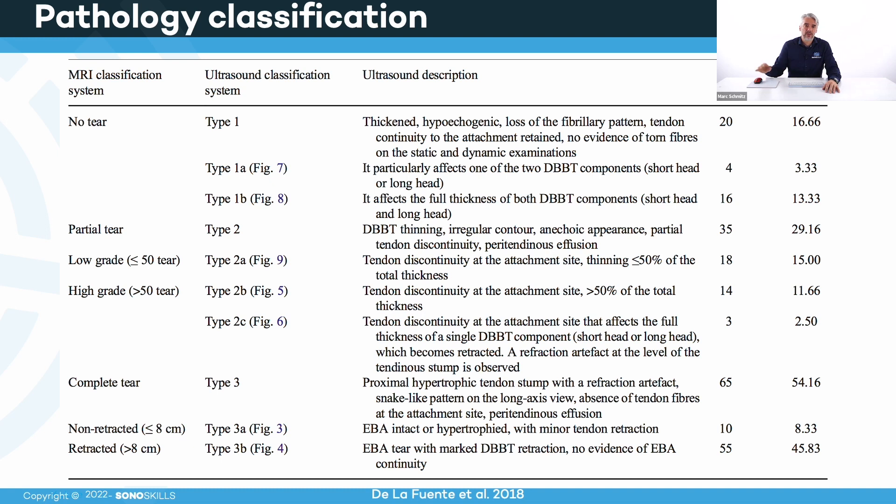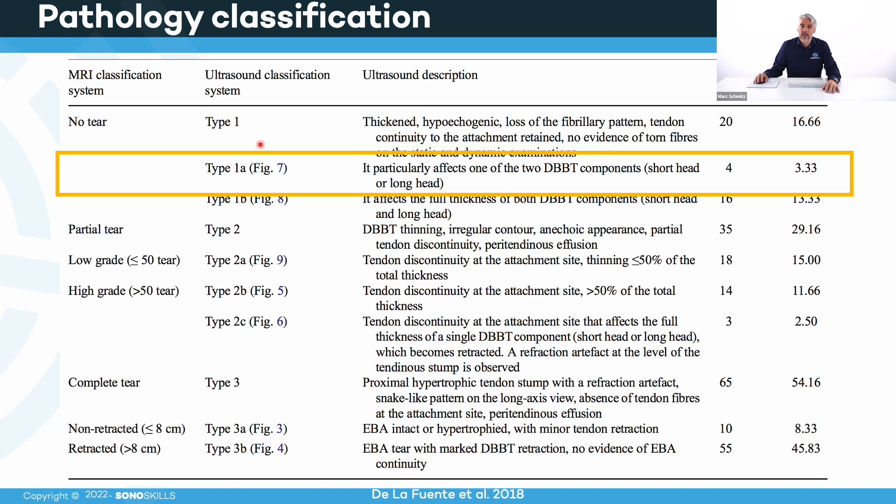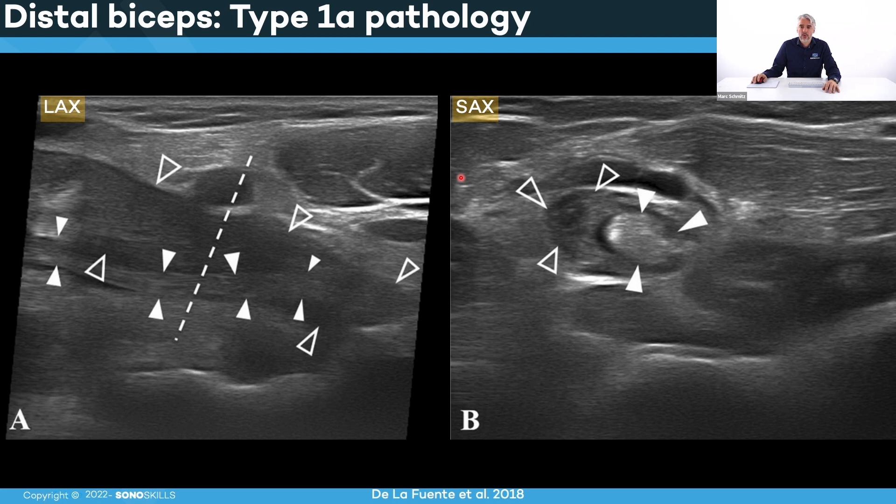I'm going to show you the classification system. It has three types: Type 1 — no tearing; Type 2 — partial tearing; Type 3 — complete tearing. In Type 1A, there is a tendinopathy that particularly affects one of the two tendons — either the short one or the long one is affected and the other isn't. In the short axis view, one part of the tendon looks hyperechoic and normal, while the other part is quite dark, hypoechoic and also enlarged — but there are no signs of tearing. So it is a tendinopathy with only one part affected: Type 1A.